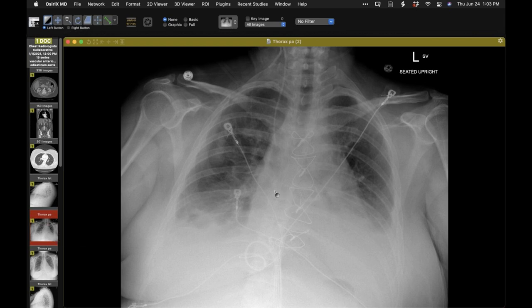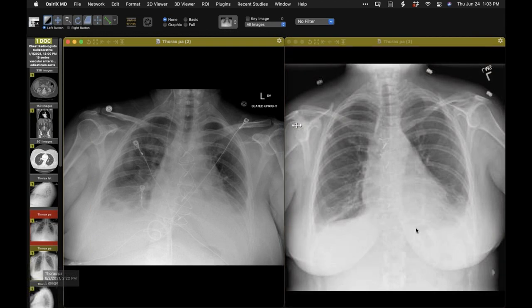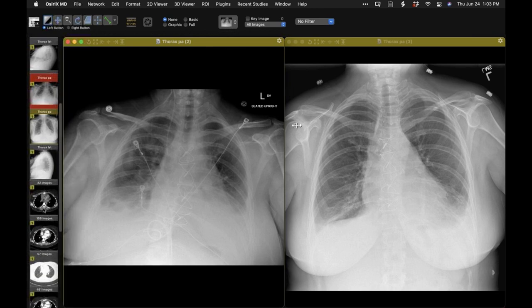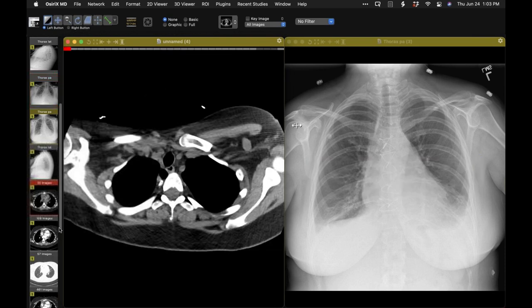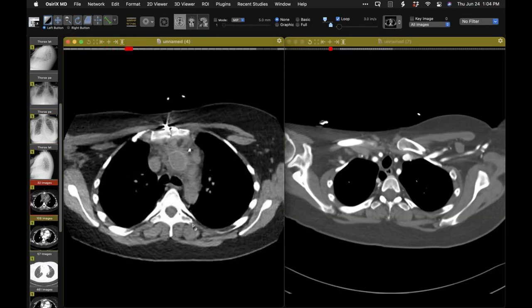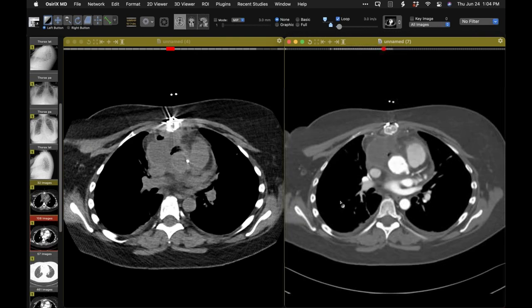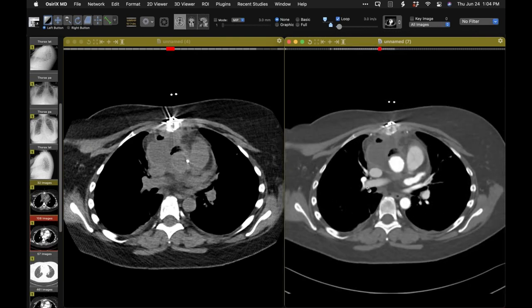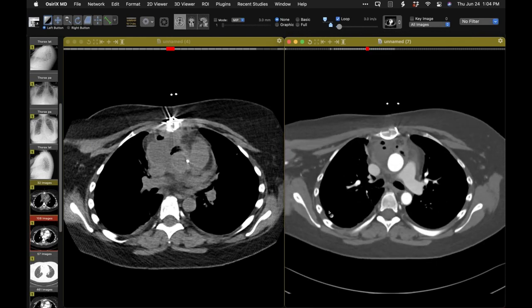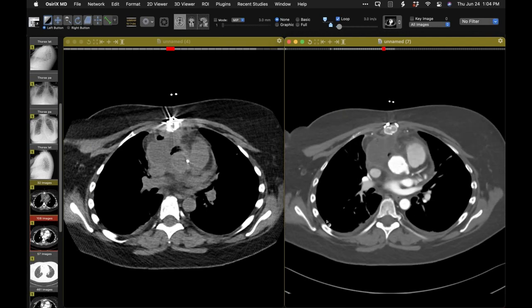You can see the prosthetic aortic valve - that's May 21. Here is June the 2nd. When I look at that, I don't see anything disturbing at that time: small pleural effusions, sternal wires look fine. A post-op imaging exam was done on the same day as that radiograph. Here are non-contrast images, here are contrast images, and you can see post-op changes. There is quite a bit of fluid in the anterior and para-aortic mediastinum, with small amounts of gas but mostly fluid.